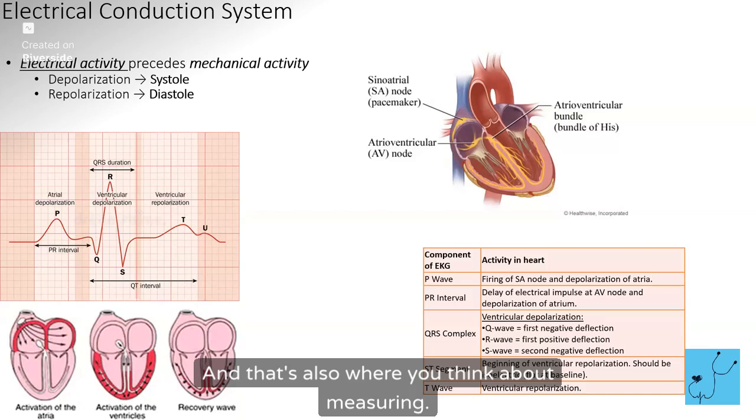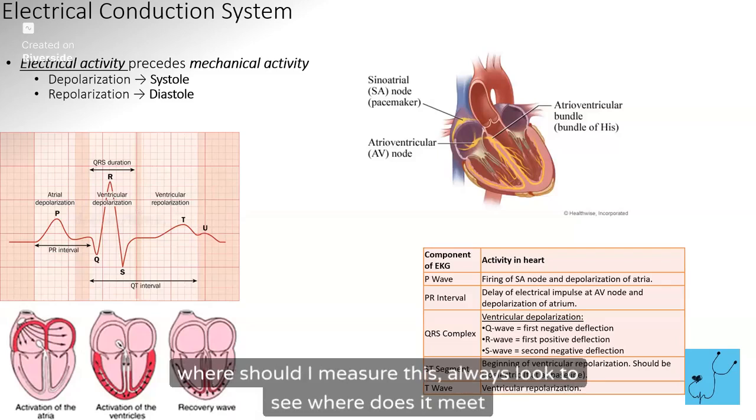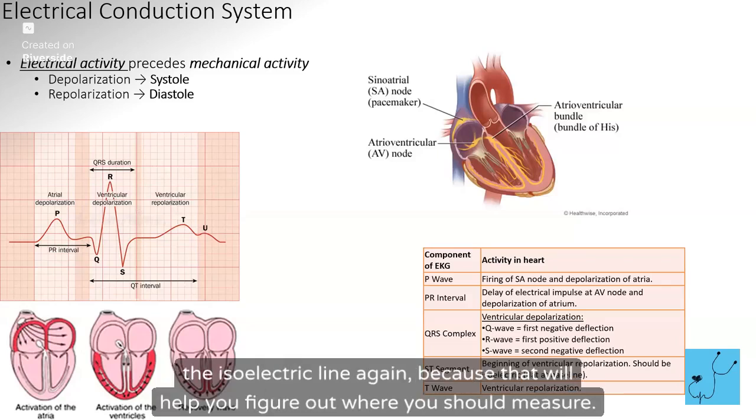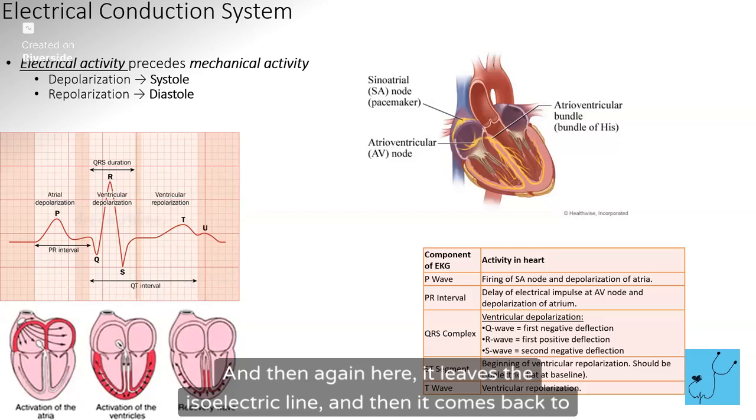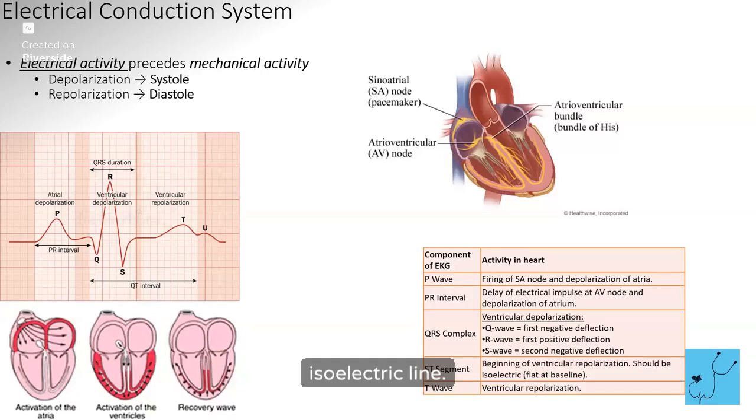And that's also where you think about measuring. If you're in a rhythm that's maybe a little different and you're trying to figure out where you should measure, always look to see where it meets the isoelectric line again, because that will help you figure out where you should measure, okay? And then again here, it leaves the isoelectric line, and then it comes back to the isoelectric line. And then it leaves the isoelectric line during rest, and then it comes back. Okay, so those are just a few things to note.